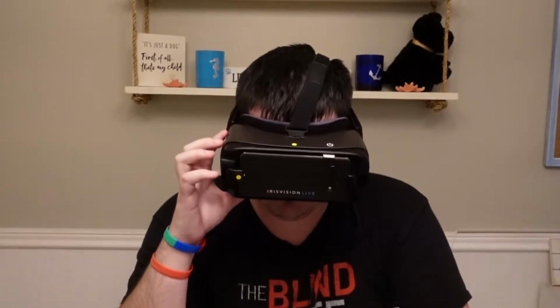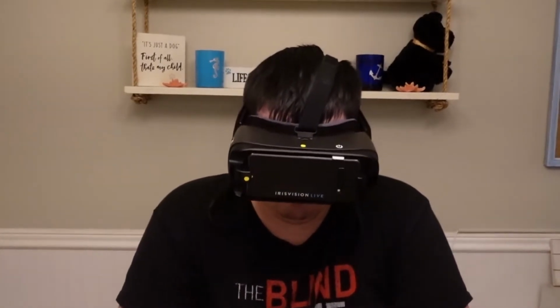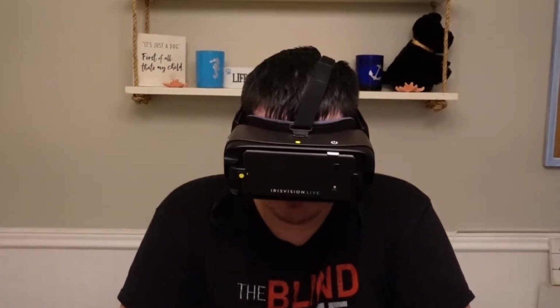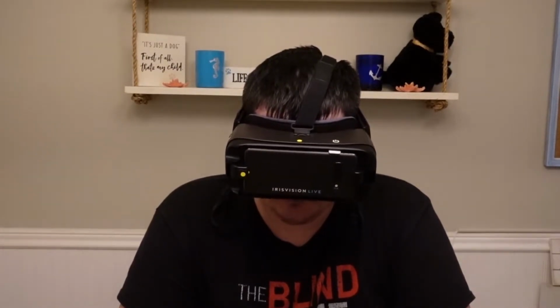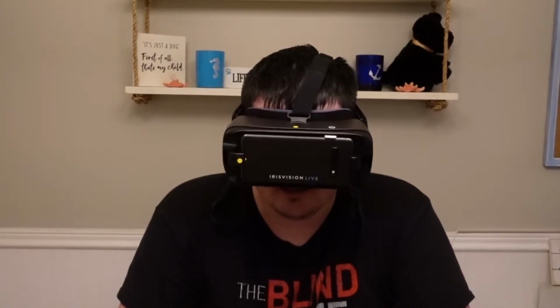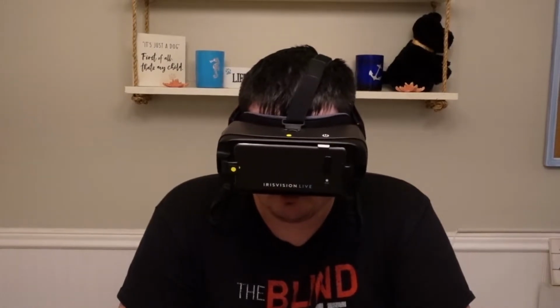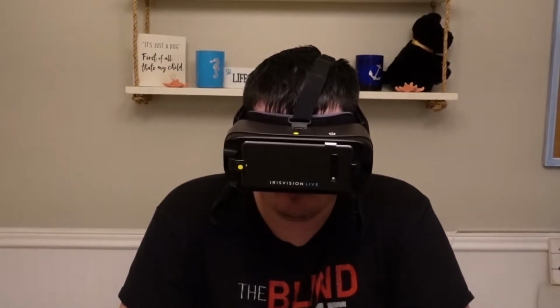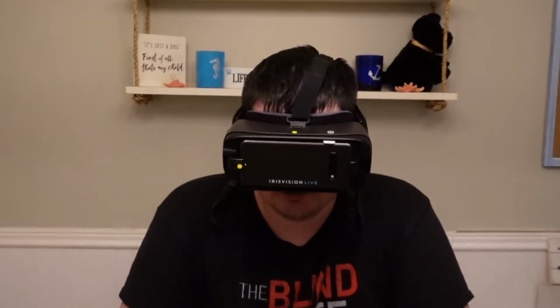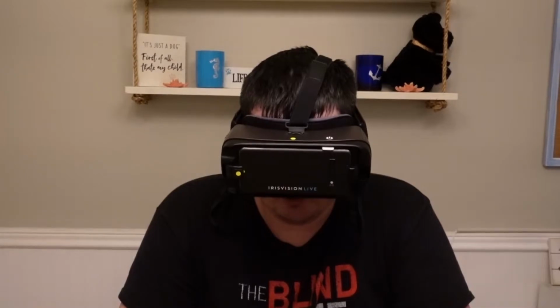So let's see. Well, tell me, does reading inverted help you with RP? Normally, yes, absolutely. It's way better than black on white. The problem with black on white is that the white background creates a lot of contrast brightness, too much haze around the words, and it just strains your eyes too much. So when you're doing inverted, getting rid of the white and replacing it with black and then having the white letters, it allows your eyes to focus more. You don't strain them as much. It's not as much fatigue. So it's a lot easier to look at something with white on black.